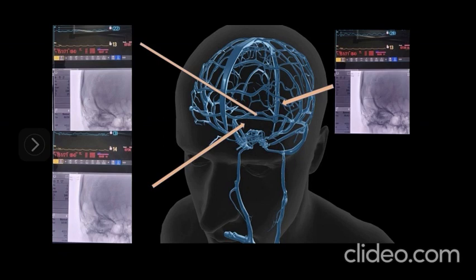In our case there was a 19 mmHg gradient. At the proximal transverse sinus it was 22 mmHg, and at the transverse sinus–sigmoid sinus junction the pressure was 3 mmHg, showing a significant transstenotic gradient.